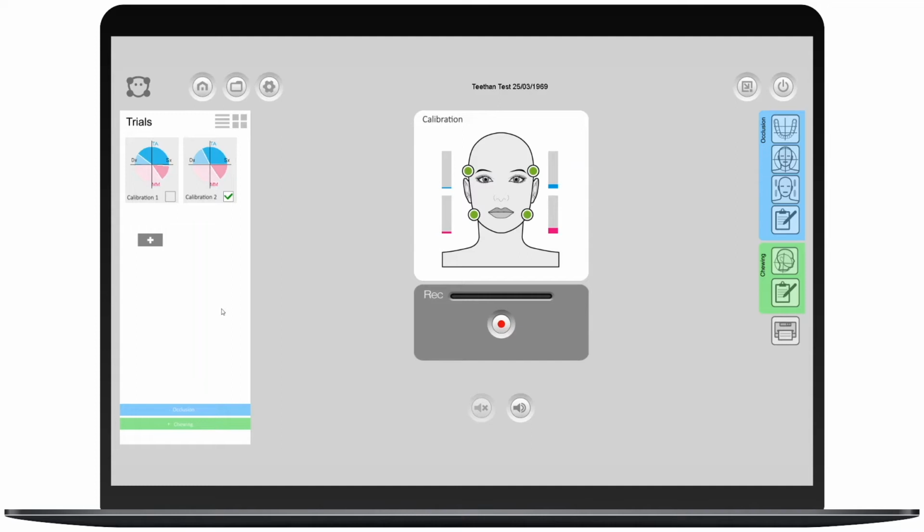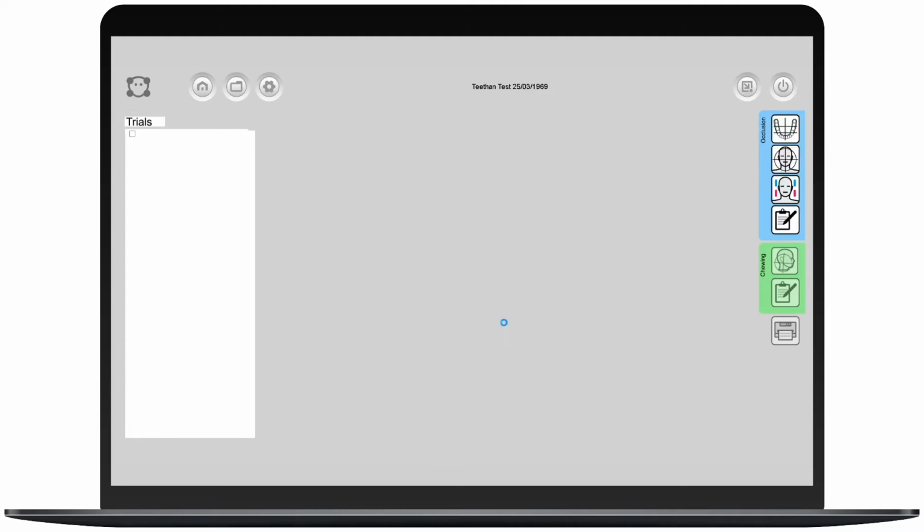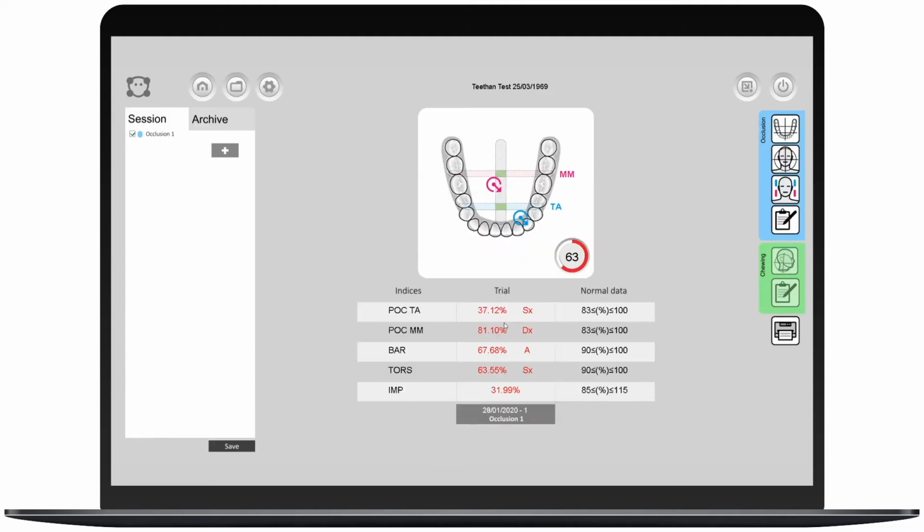The acquisition test is the real occlusion test. For this, remove the cotton rolls and ask the patient to perform a maximal clench, allowing the natural intercuspation of teeth, and start the acquisition by clicking on the record button, asking the patient to clench for 5 seconds. You can complete this test multiple times to allow for pre- and post-treatment comparisons by clicking the plus button.